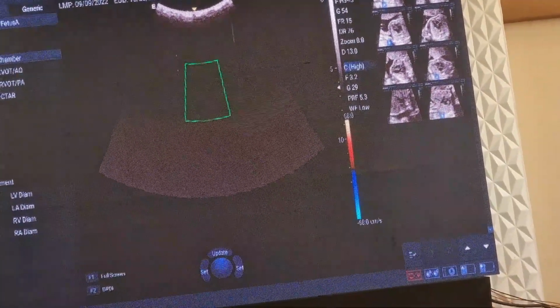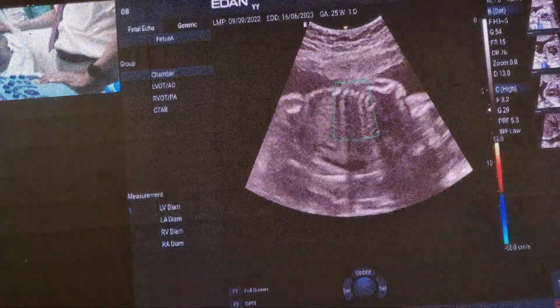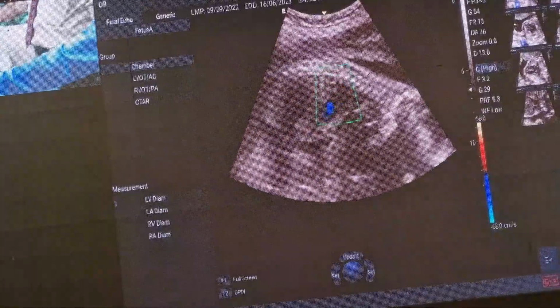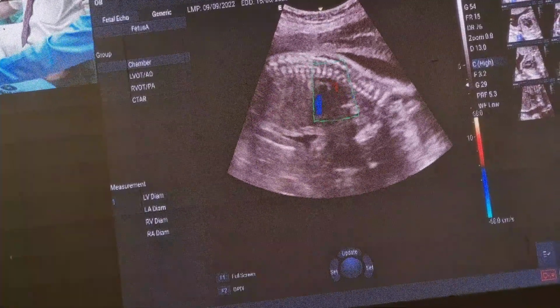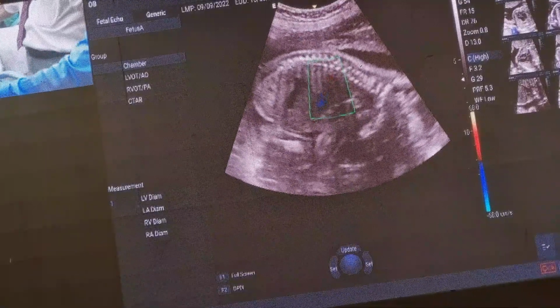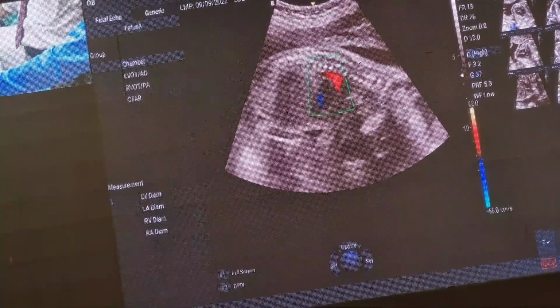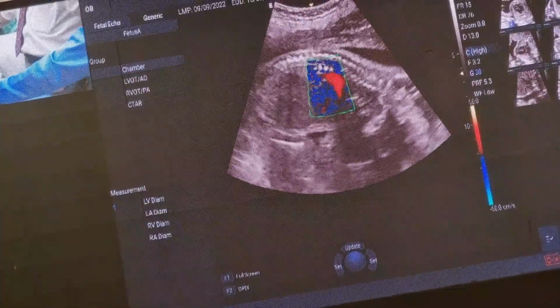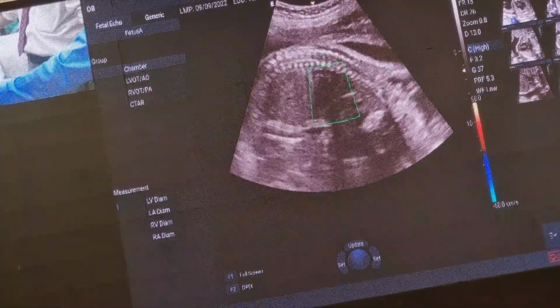It's a trifurcation, it is not a bifurcation, it's a trifurcation. Okay, the term may be different, whatever. Okay, now increase the color. Yeah, quick. So because of the spine, this is the flow across the ductal arch, right? Yeah, that's right.